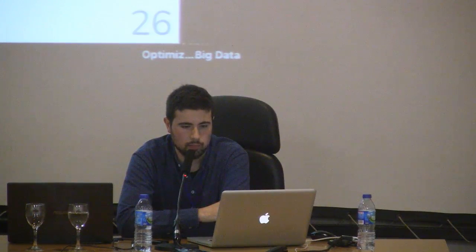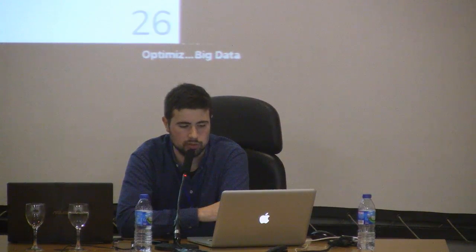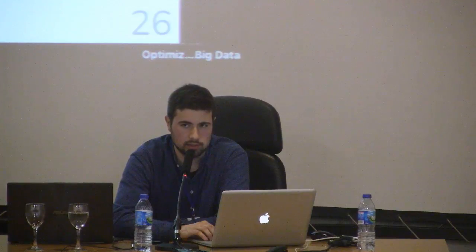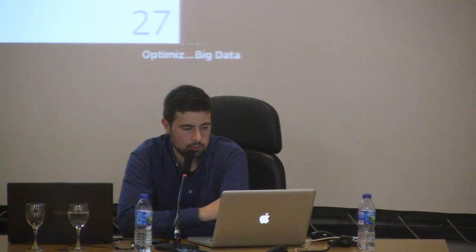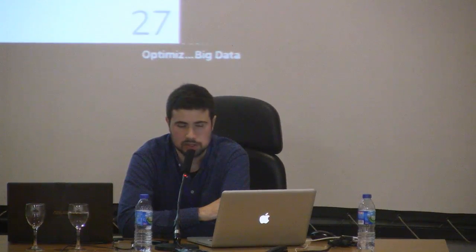And these, while they're really, really useful, have quite a huge caveat, which is that the performance is lower, they take a lot of time to install, and they're really not portable. You're doing an installation on your computer specifically, and it takes a lot of time to start up, because if your computer is slower, the virtual machine is going to be a lot more times slower.